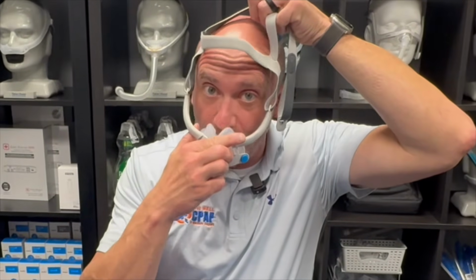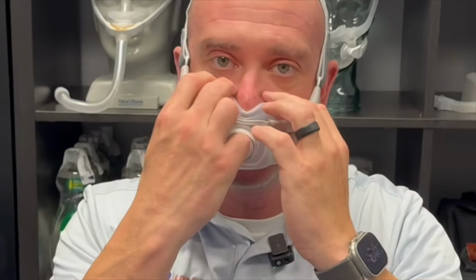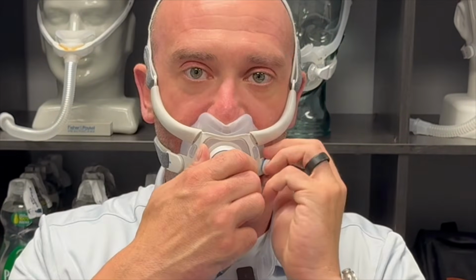A lot of times people who aren't used to the under the nose full face mask will kind of dig their nose in. But you want your nose to fit right in between the two sides, so sit right down in the valley. And then this is going to pull down. These have magnets on it, so it's going to get close, and you'll notice it pulls right into the mask. And then you want to adjust all 4 adjustments on this mask, the bottom and the top, so the mask goes in very evenly. So I'm going to tighten the top a little bit, tighten the bottom a little bit.